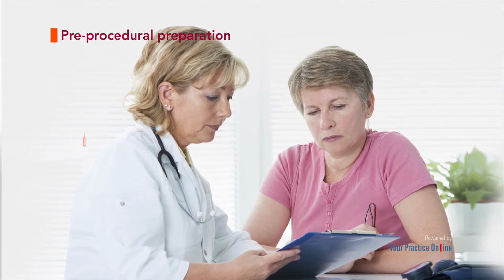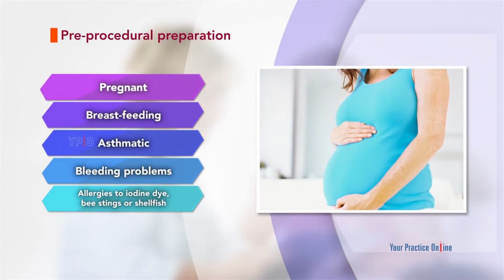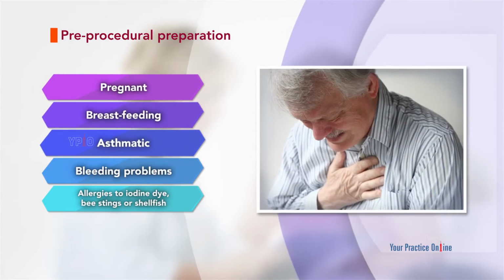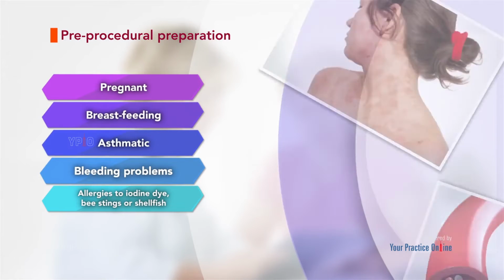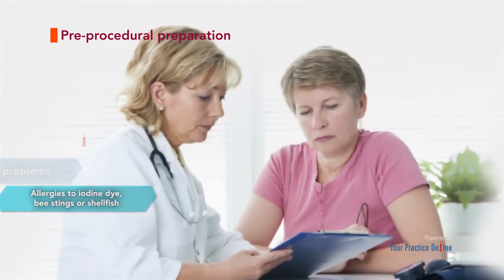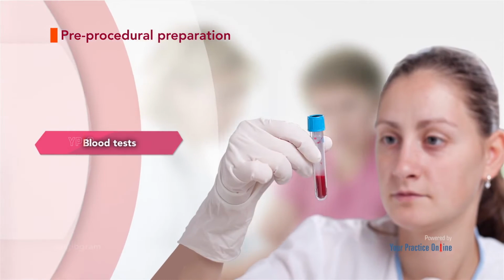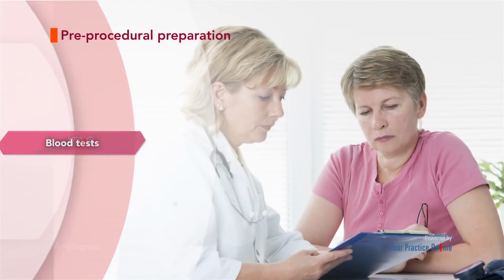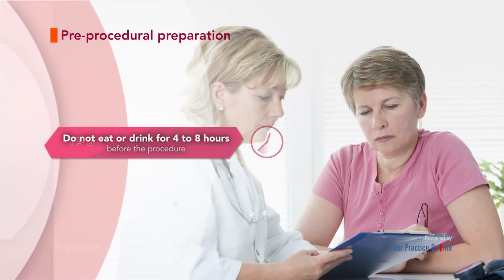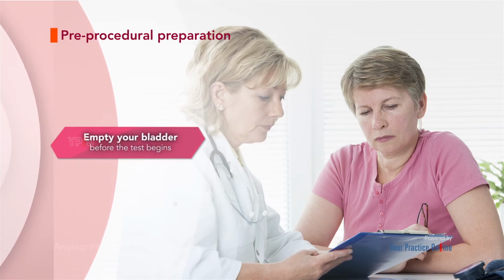Pre-procedural preparation. Before an angiogram, inform your doctor if you are pregnant, breastfeeding, asthmatic, have bleeding problems, or any allergies to iodine dye, bee stings, or shellfish. Your doctor will ask you about the medicines you are taking and review your history. Your doctor may order certain blood tests and will advise you not to eat or drink for 4 to 8 hours before the procedure. You will be asked to empty your bladder before the test begins.